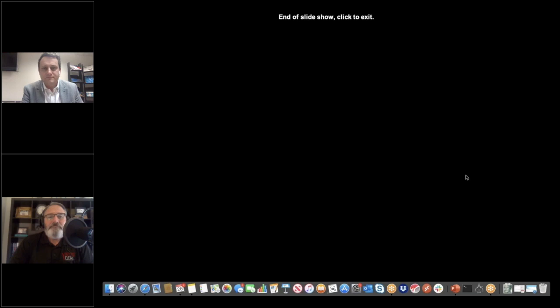Anything to add, Bob? Yeah, I agree with that 100%. Often I'll see folks marking after the fact and they don't passivate, which then they'll start seeing elevated incidences of corrosion for sure. Yeah, well, I think the concept essentially of a laser mark, and modern laser markers have an annealed setting. So Gordon, that's probably something to consider, because I think that does tend to essentially seal the device or oxidize the mark after you use it.